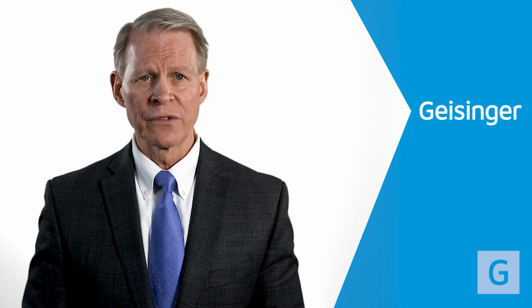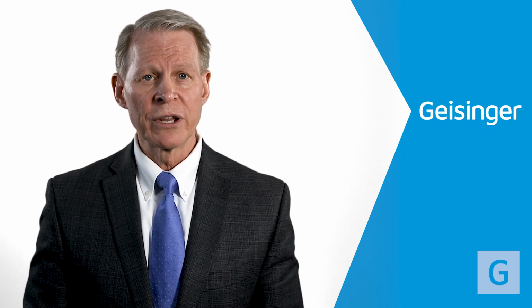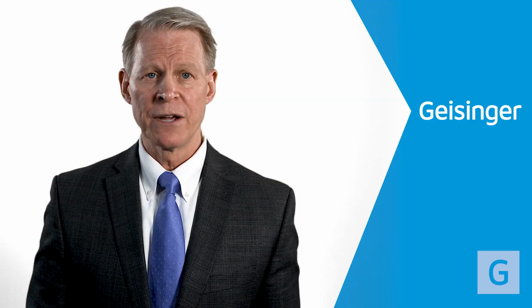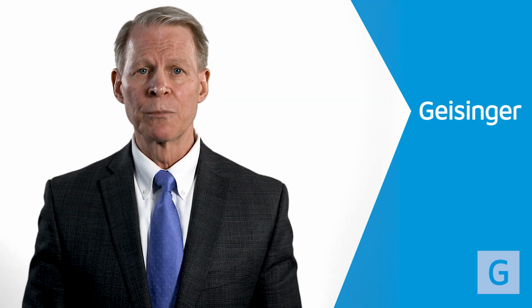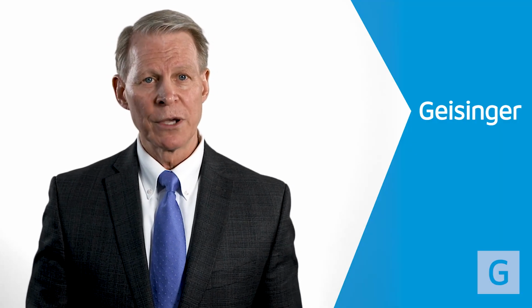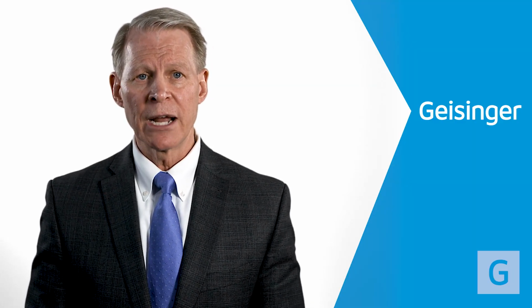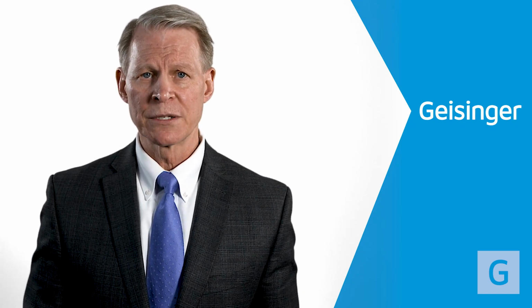This arthritic process, or the joint, gradually becomes painful, can limit function, quality of life, and activities of daily living, leading to muscle weakness and reduced function. When more conservative treatments fail to relieve the symptoms, knee replacement surgery becomes an option to improve pain, mobility, and function. During knee replacement surgery, while you're asleep, usually under spinal anesthetic, the damaged bone and cartilage are resected and replaced with implants, also called prostheses or total knee arthroplasty.